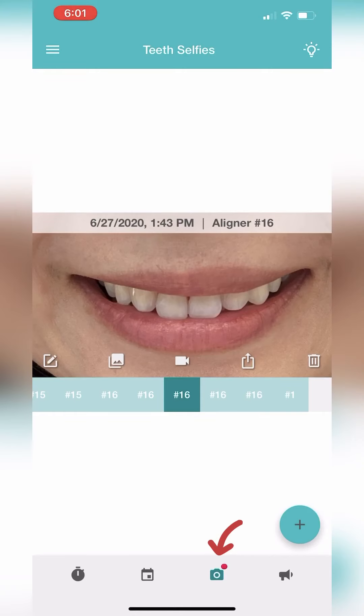The next tab is the teeth selfie tab. You can take pictures, edit pictures, compare two different pictures, and even make a video of all your teeth selfies to save or share.